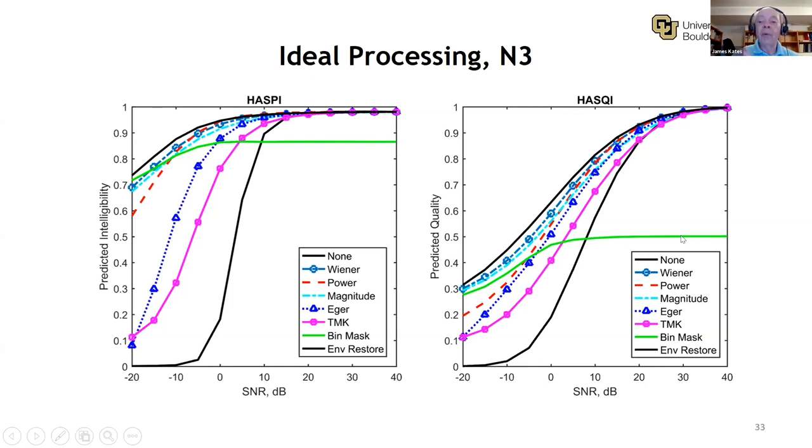A gain of 1 if you want to keep that time frequency cell that has a positive SNR, 0 if you don't want to keep it, that time frequency cell has a negative SNR. So we have lots and lots of instantaneous gain changes, or nearly instantaneous changes, and that generates lots of modulation sidebands, lots of spectral splatter.